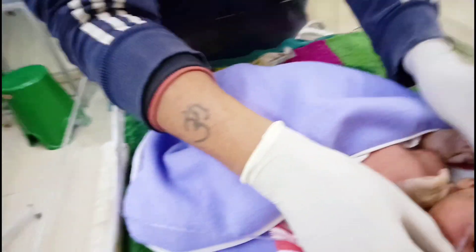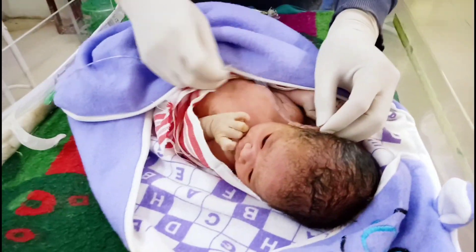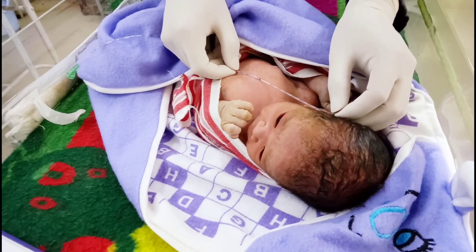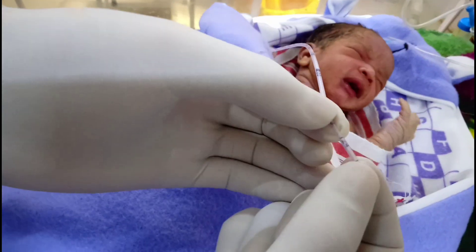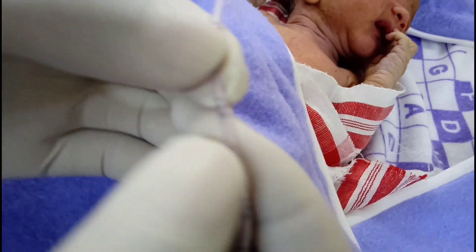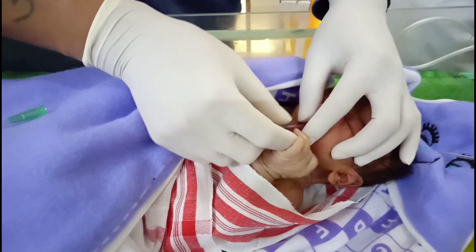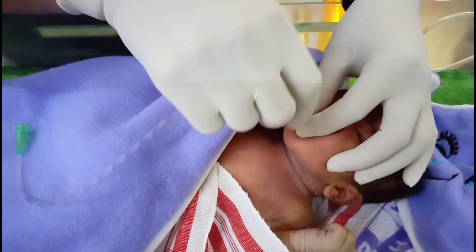I am measuring first up to what point of the tube is to be inserted through the oral cavity to the esophagus and then to the stomach. We measure from the tip of the nose to the upper tip of the auricle, and then from the upper tip of the auricle to the lower xiphoid.